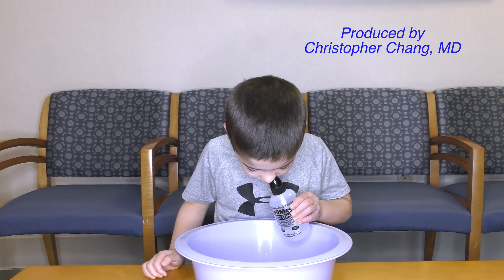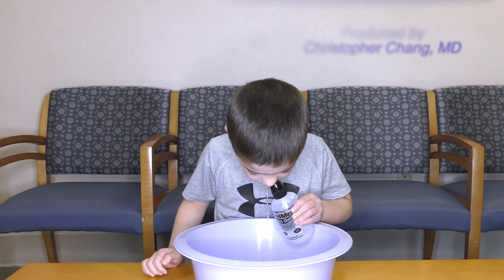Sinus rinses can be performed up to four times a day or as needed.